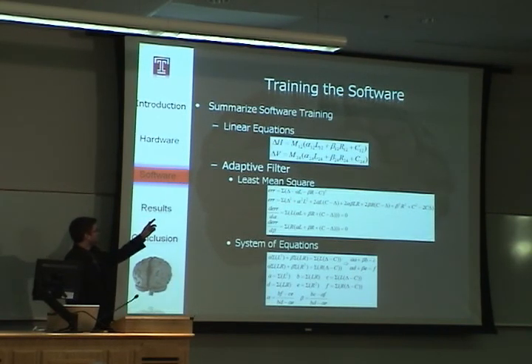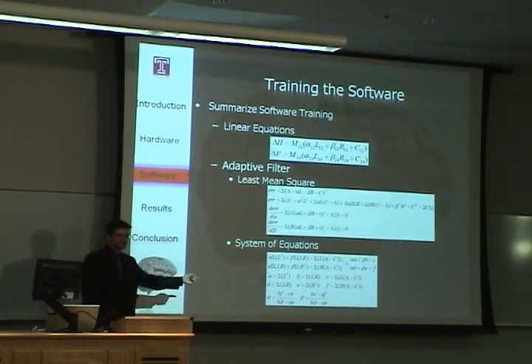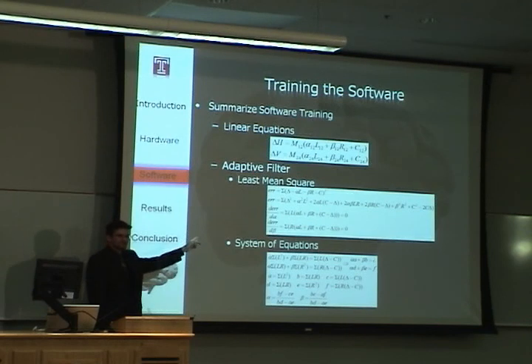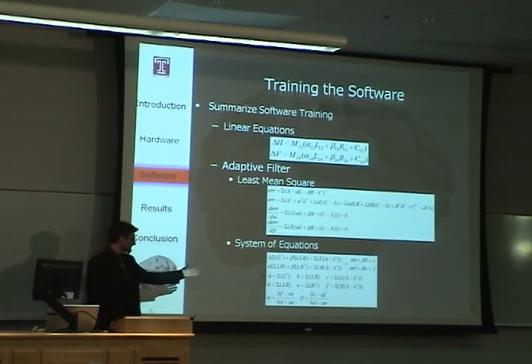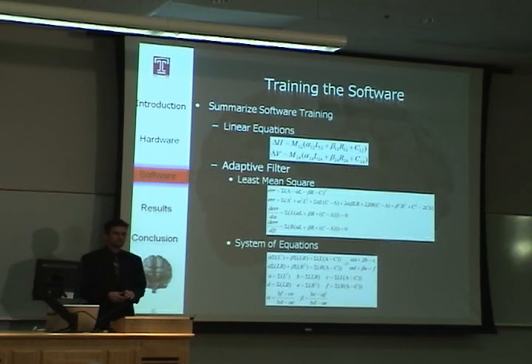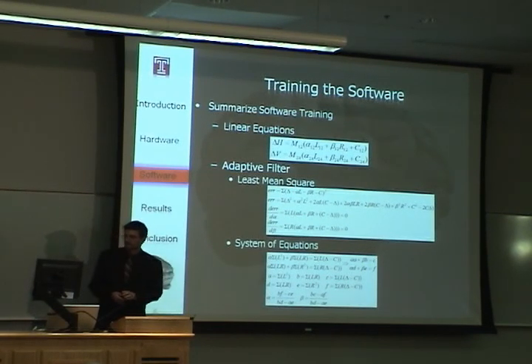So we already saw the linear equation at work in the beginning. Least mean square, they kind of tossed under the rug in the system's equations, is what's going to actually solve these things for it. So the program itself, however, actually has this equation written out just this way. And I'm just working on that to give you a simple set of equations in order to show how we got to the results that we did. We'll leave it to Lee to discuss that.